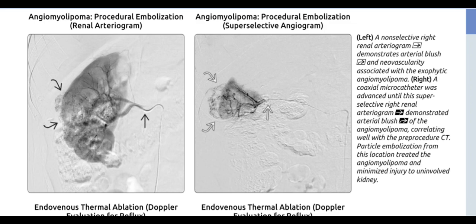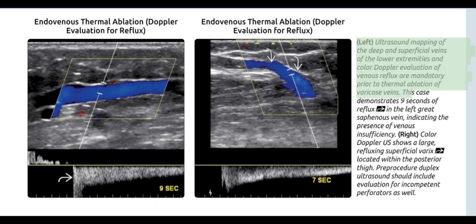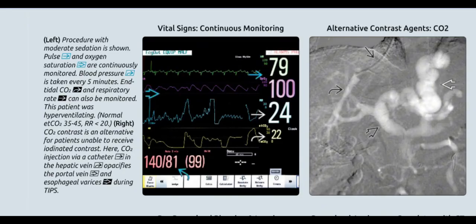Ultrasound mapping of the deep and superficial veins of the lower extremities and color Doppler evaluation of venous reflux are mandatory prior to thermal ablation of varicose veins. This case demonstrates nine seconds of reflux in the left great saphenous vein, indicating venous insufficiency. Color Doppler ultrasound shows a large refluxing superficial vein located within the posterior thigh. Pre-procedure duplex ultrasound should include evaluation for incompetent perforators as well.